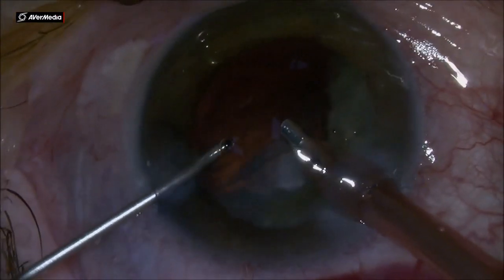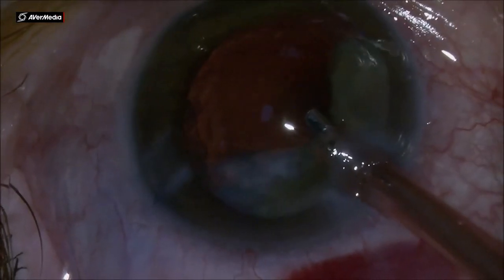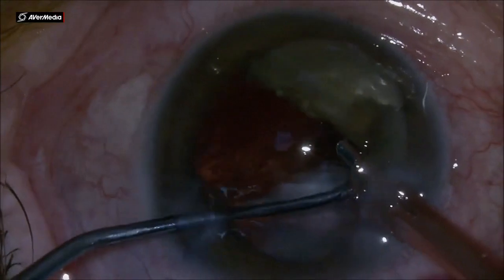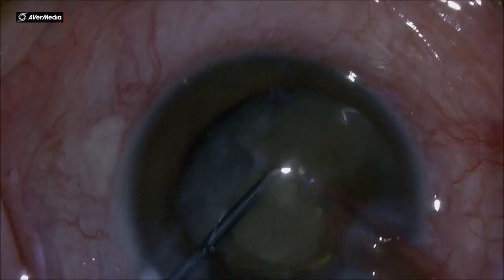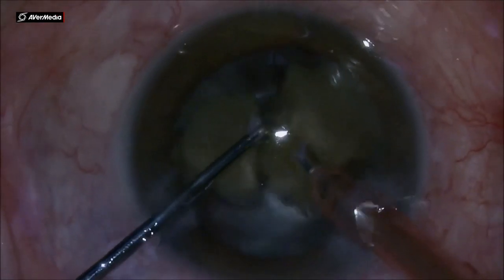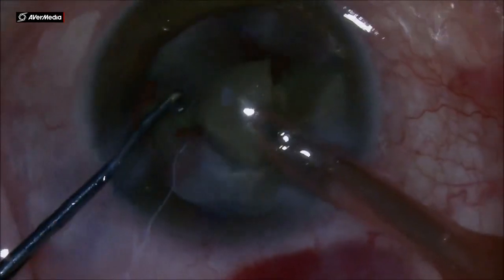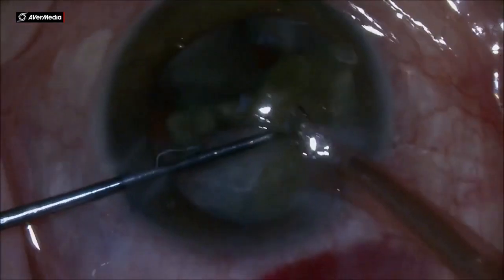Stopping in the middle of the phacoemulsification and replenishing the bag and AC with viscoelastic, and then getting to the last part of the nucleus, the last heminucleus, and again engaging with the phaco probe, and then using the chopper to divide and split those parts into smaller pieces, so it will be easier to just aspirate, not use so much phaco power, and not use the vacuum to the maximum capacity of this machine.